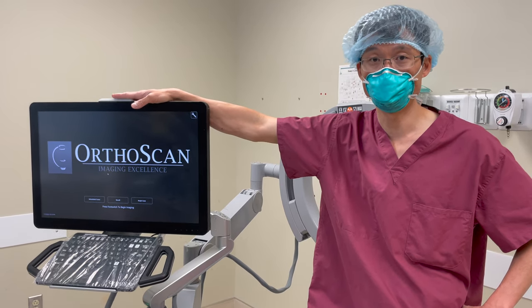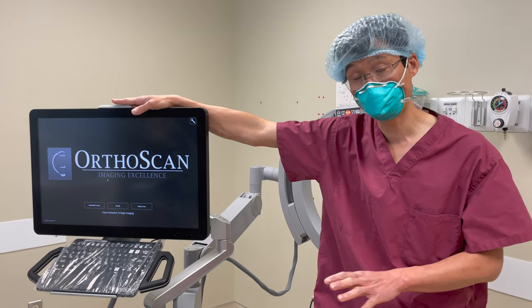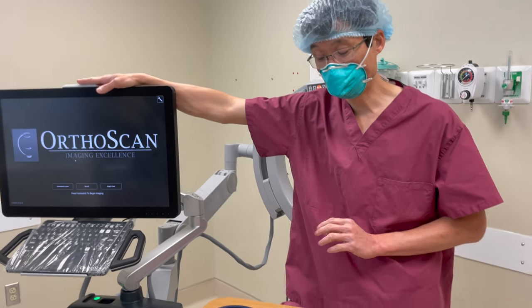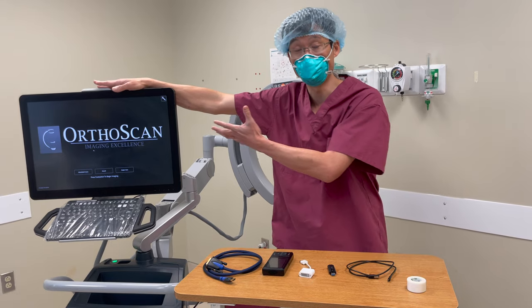It's a great mini c-arm but it does have one problem — you cannot record live video of what you're doing on this machine. We figured out a way to do it using the ClearClick video capture box, and this device allows you to capture live video feeds that you can see on the monitor as if you were in the operating room.